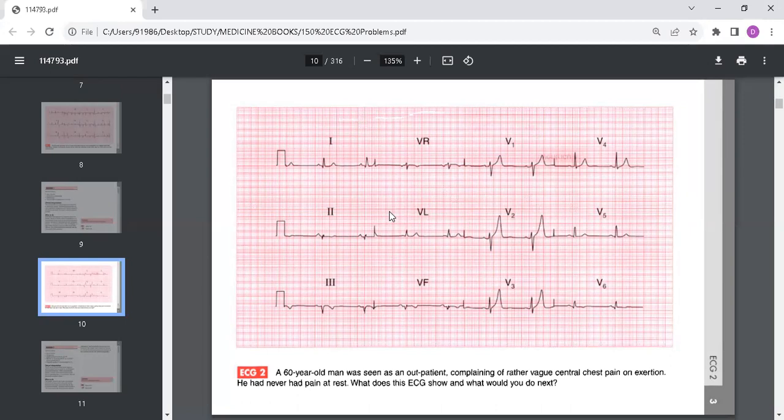The clinical interpretation is that the Q waves in the inferior leads together with the inverted T waves point towards an old inferior myocardial infarction.